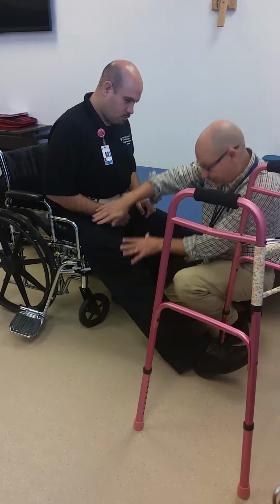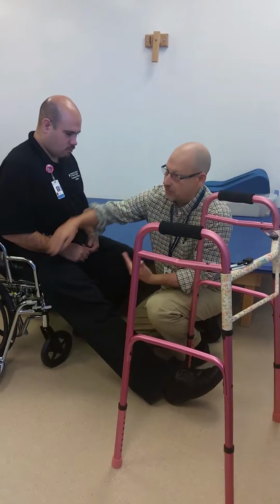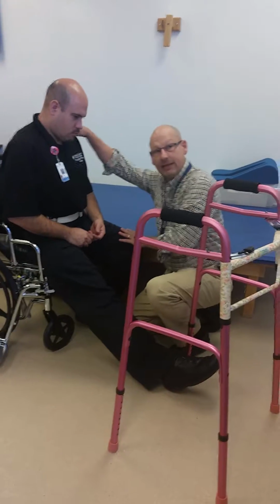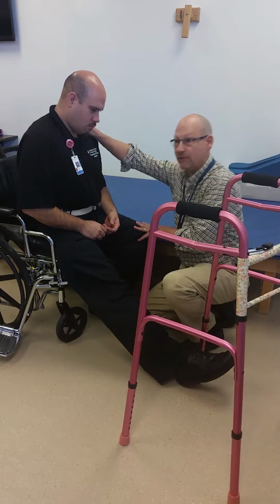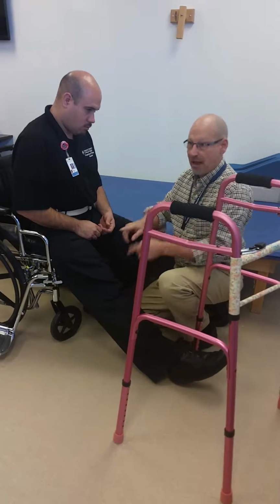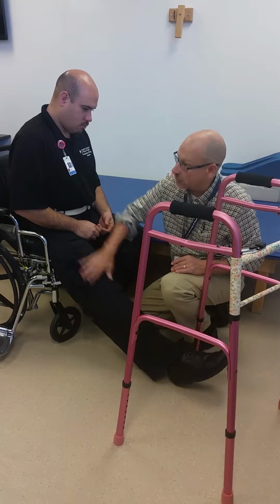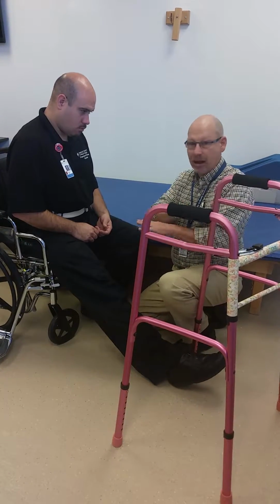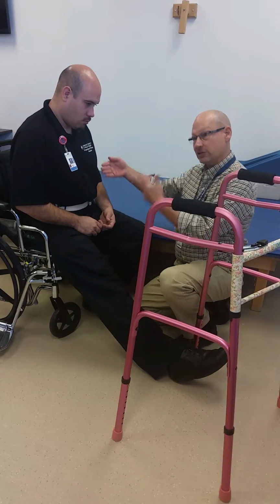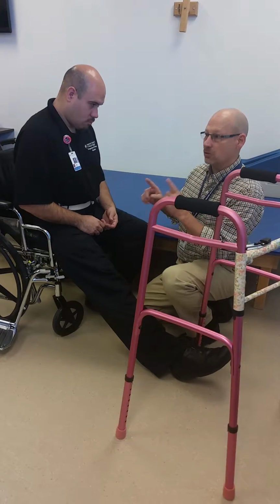Good, right? So that's the whole purpose of extending the leg, is it opens up the angle of the femur to allow the patient to lean forward so he can get his center of gravity over his base of support. That's good. It's bad because it means he can only use one leg to stand up. When you put your leg out like this, you cannot use it. Biomechanically impossible to use it for support. So it's good because it allows him to lean forward. It's bad because it decreases his base of support. But that's the way to do it.